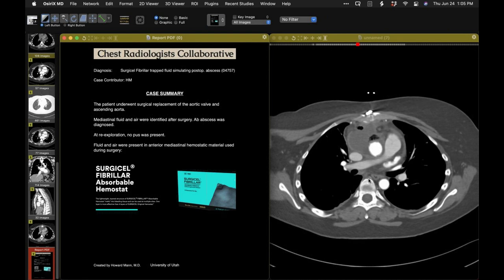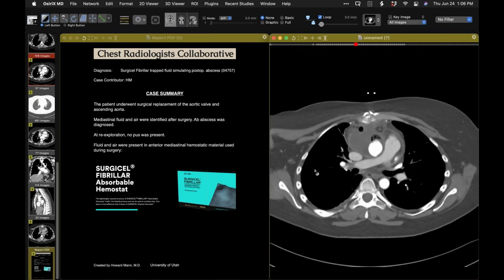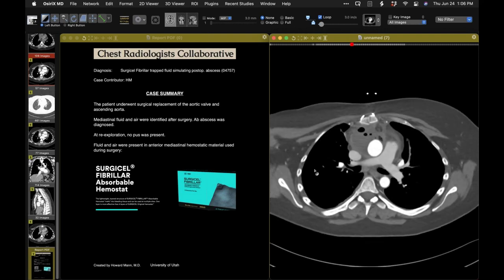So what is Surgicel? I think this is a product name - 'Surgicel Fibrillar' - though I don't know what the term fibrillar applies to. This hemostatic material can certainly retain fluid and some air. We've seen cases before in the mediastinum in particular where fluid and some air associated with Surgicel suggests the possibility of an abscess. So not an abscess in this instance, but it's worthwhile trying to remember to find out where the Surgicel was used.